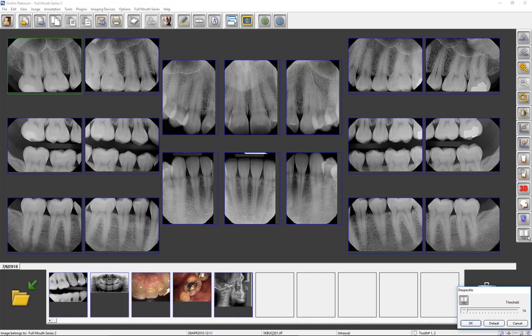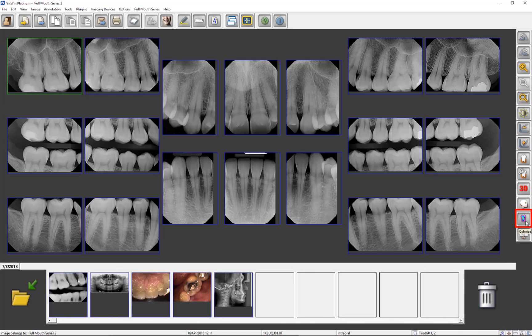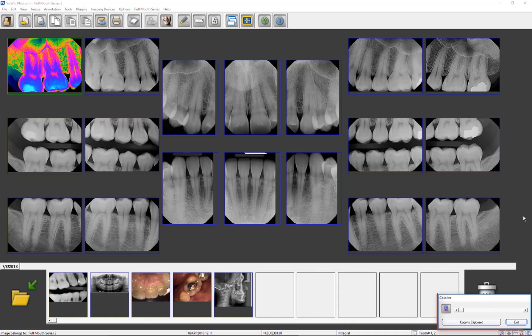The image appearance will only change if there is evidence of graininess. The Colorize feature assigns a color to each unique shade of gray to produce a pseudo-color image of the selected image. This function may enhance the detection of subtle differences in radiographic density. When Colorize is selected, it is automatically applied to the selected image.